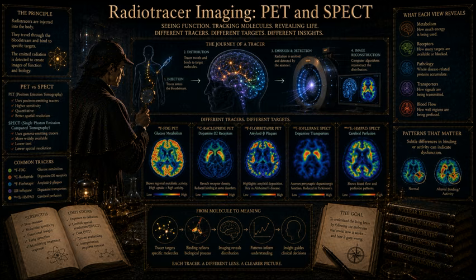It is a biochemical roach motel. The tracer checks in, gets phosphorylated by hexokinase, and it can never check out. That is a perfect description. Because it is trapped, the curve never equilibrates and comes back down. It just goes up and up.